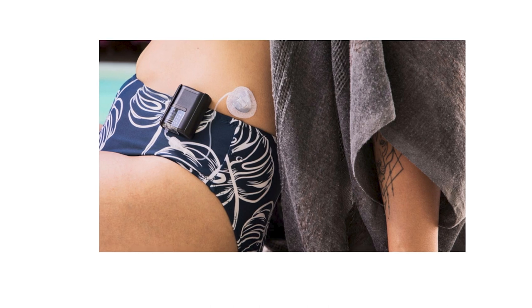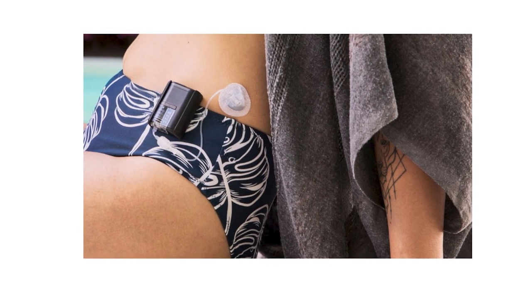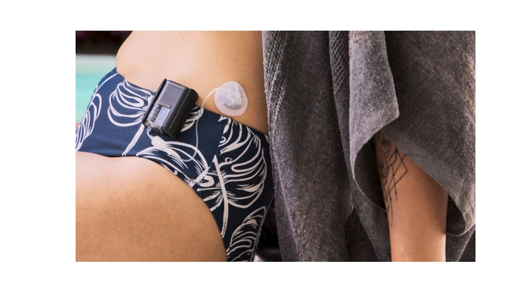Let me know — what do you think of this thing? Would you wear this? If you're wearing a tubeless pump now, would you consider going to a tube pump if it really is just five inches? And if you have a longer tube pump, would you consider switching to this for that added mobility? Let me know in the comments.